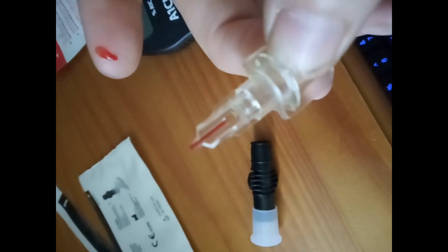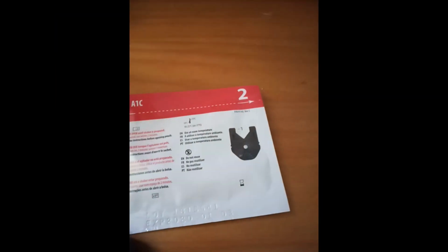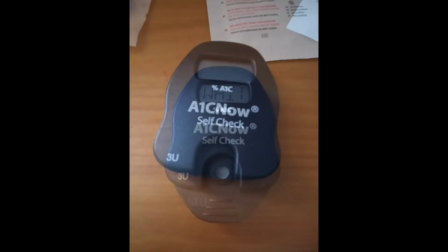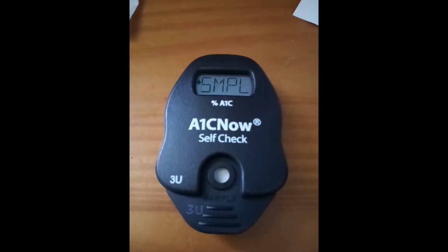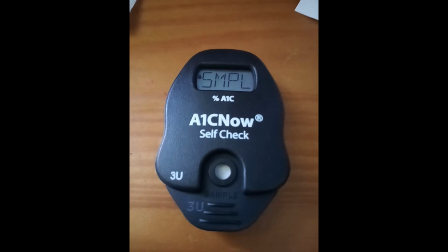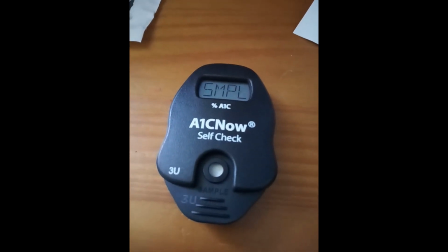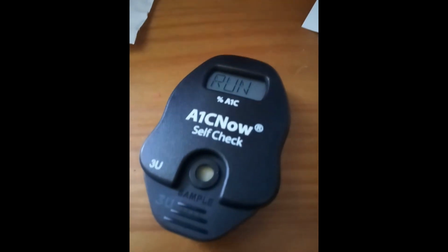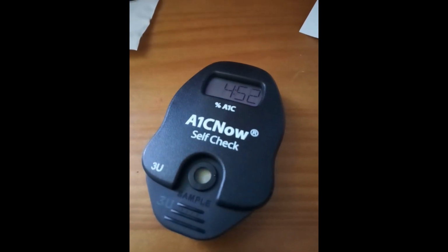So that's bit number 1 done. Let's get on with the rest of it now. Right, now to open pouch number 2. Take that little unit and slot it into there. So the 2 codes match, so that's all good. Now we have to wait for the checks to do their job. Okay, once it says SMPL, that's it. You need to get the sample and plug it in. So after doing that, run appears and then a countdown.